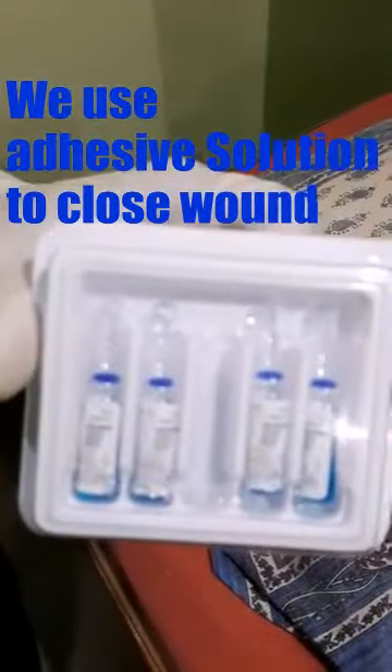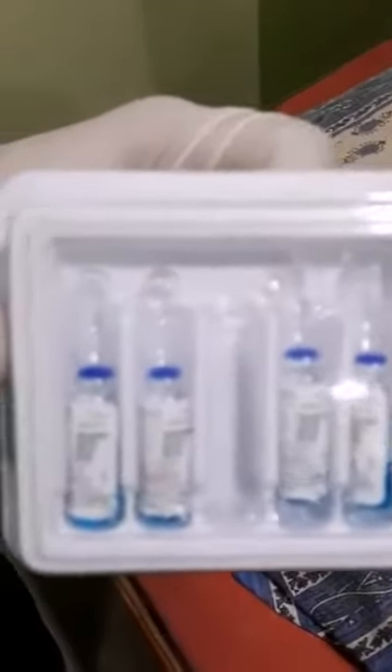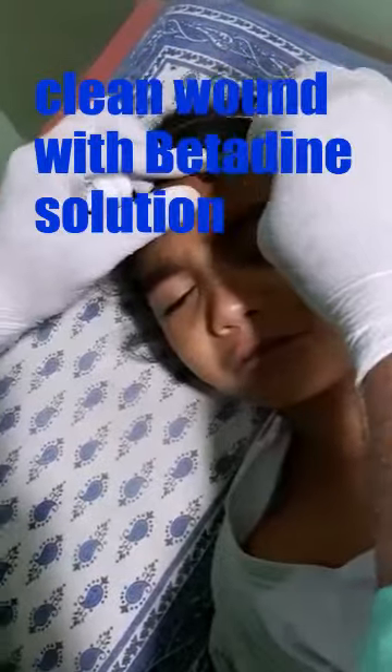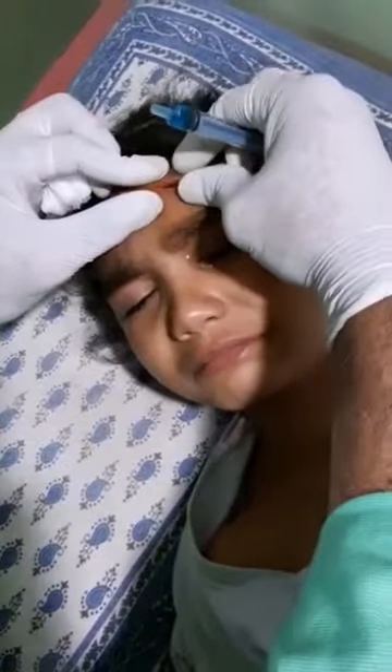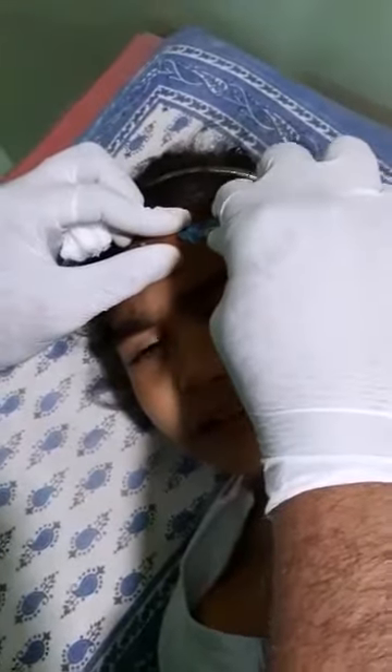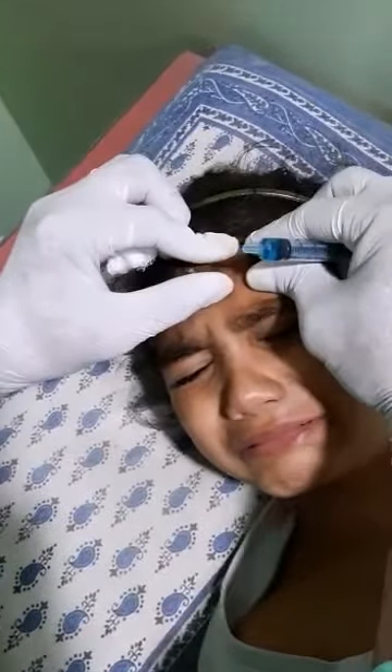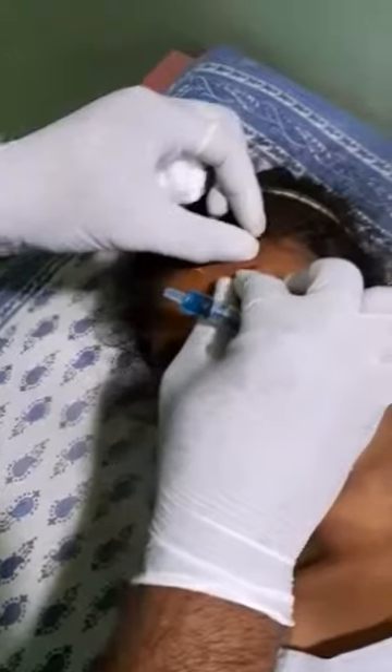Dr. Praveen Sahave here. This is a case of head injury — a 1x1 cm small cut over the forehead. A small girl was playing in the house and suddenly she fell and is having a wound over her face. She doesn't allow suturing of the wound.